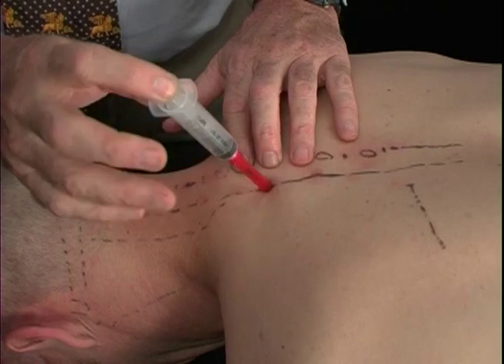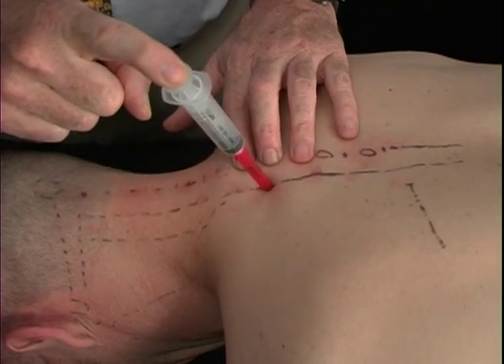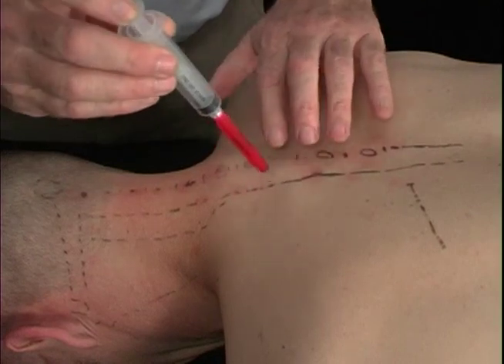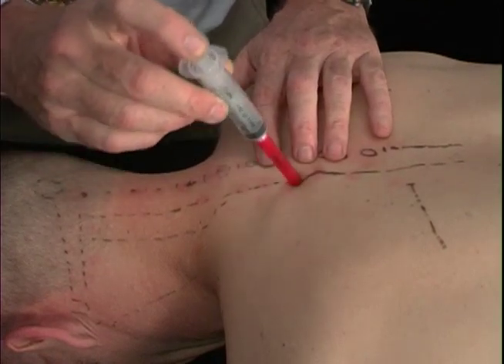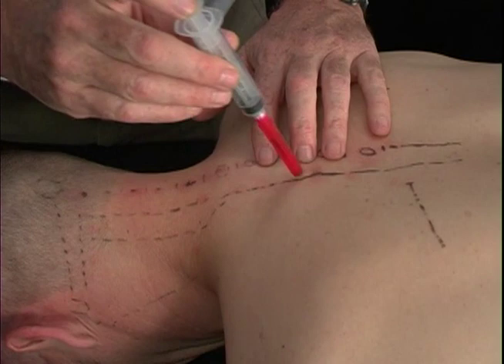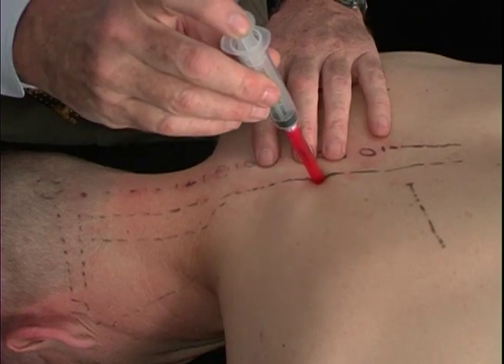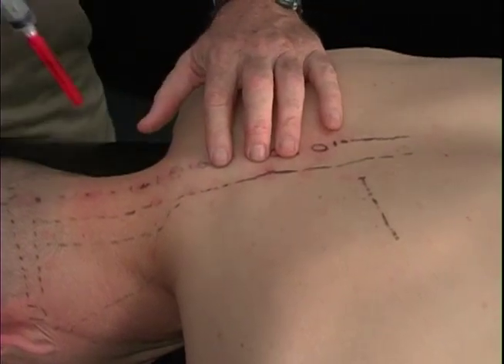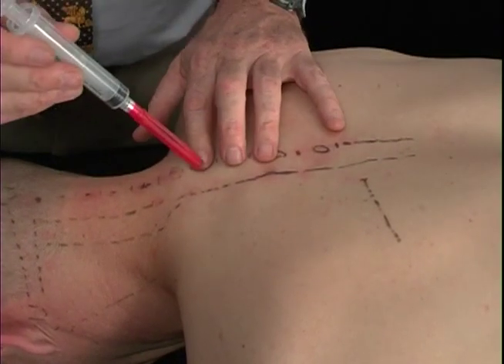This allows the needle to penetrate down into the facet area and keeps the needle from drifting off into the lung. These injections should be fairly close together because we're hitting both the facet and the areas between the facet as we walk down here. We can do this in a couple of different ways.